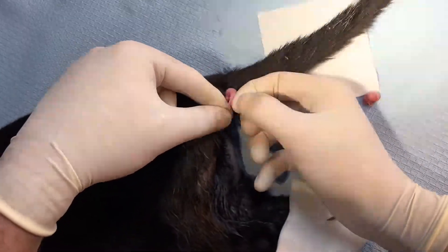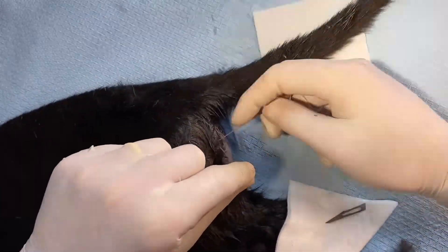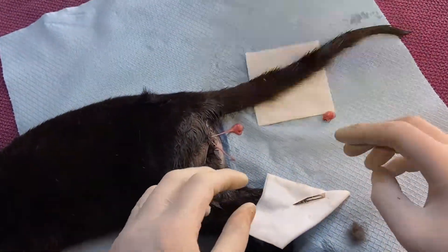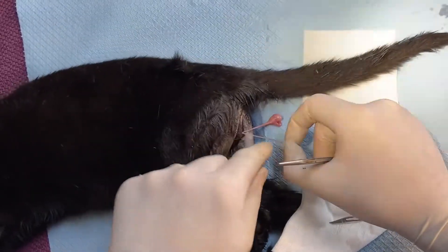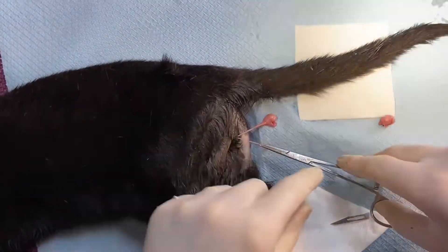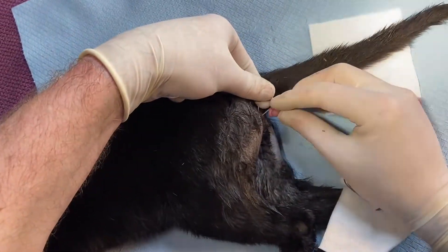I'll show you a trick if ever you're running out of cord or it snaps and you haven't got much length left. For example, if this has snapped and we've only got a small piece left so we can't do our ties — just use the forceps, like that.